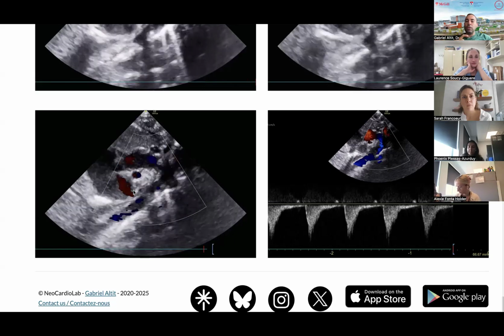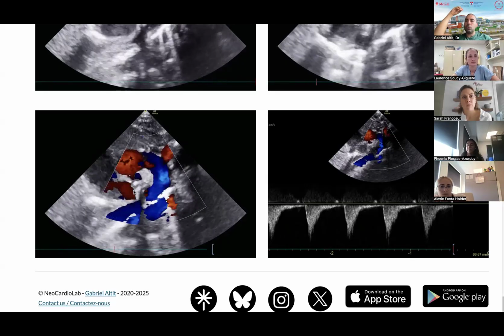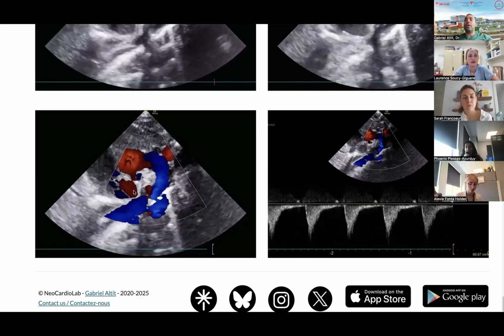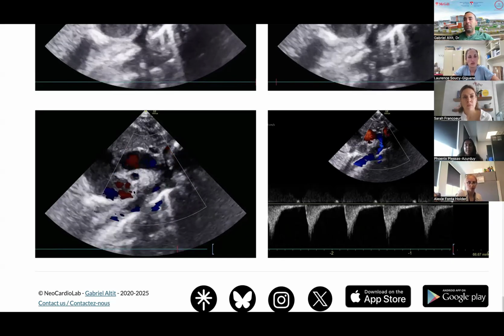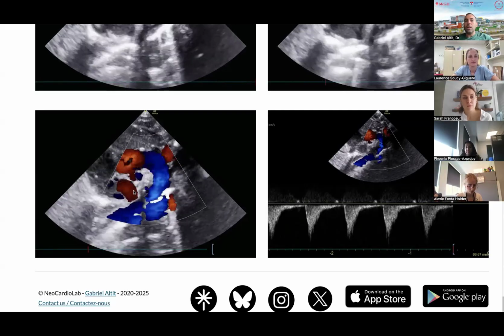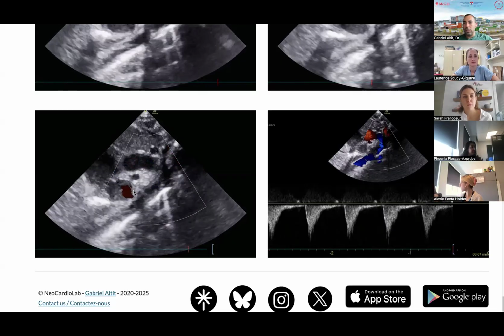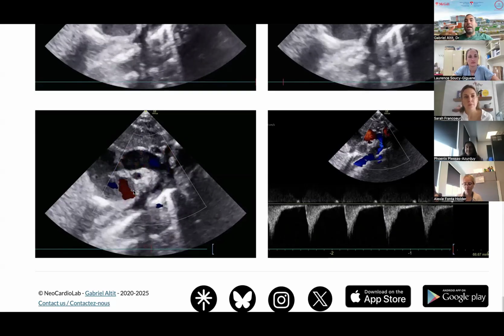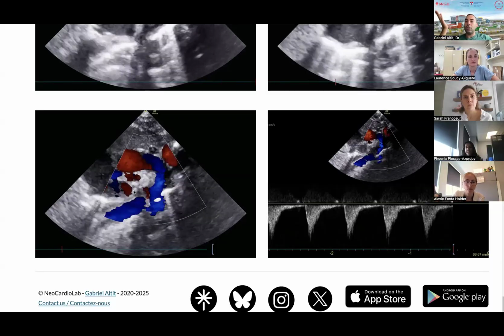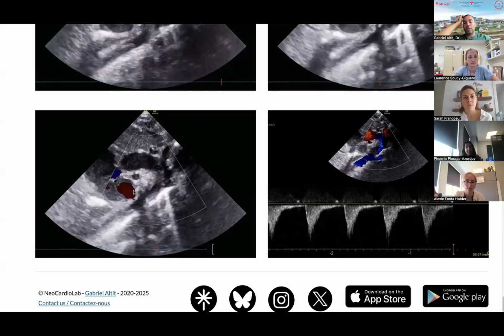It's because the cumulative territories of vascular resistances make it so that it steals towards the brain, because the vascular resistances in the brain are so low compared to the systemic vascular resistances, where the baby's on cooling and vasoconstricted everywhere because of the hypothermia and because of all the catecholamines circulating from all the stress that the baby lived. And so you'll see sometimes this brief or even holodiastolic retrograde flow in this particular context. So that's part of your differential diagnosis.